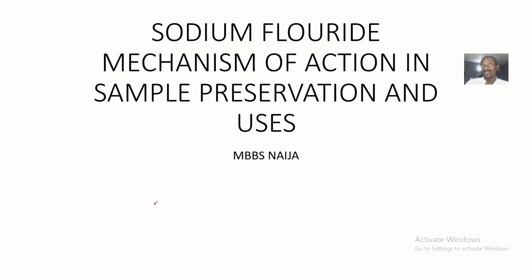So guys, in the laboratory, there's always a need to preserve samples, all right? Because you collect a sample and you're not ready to use it now, or it could be that you collected a sample and you need to transport this sample to another laboratory somewhere to use it, all right? So you might want to preserve this sample, okay?